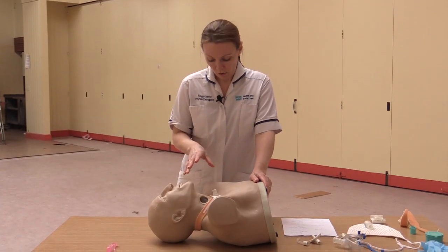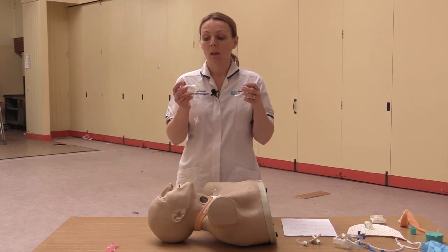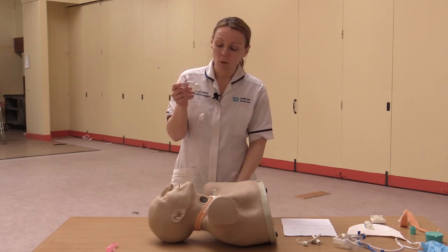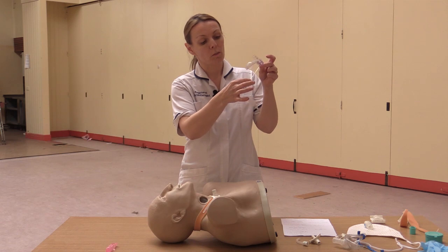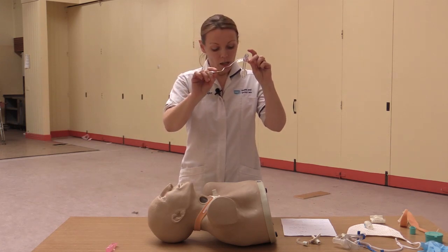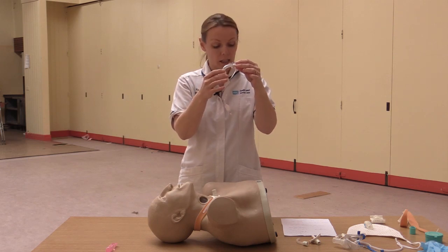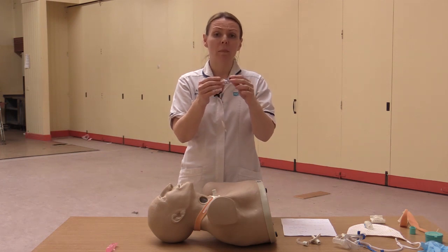So we're just going to talk about trachea tubes. There are two different types of trachea tubes: cuffed ones and uncuffed ones. Starting with the cuffed tube, you'll know it's a cuffed tube because there is a line coming from it, and you'll know that the cuff is up because you'll be able to feel the air at this end. Okay. If the cuff is inflated, it maintains a seal in the airway, and it limits the ability to speak and to swallow.